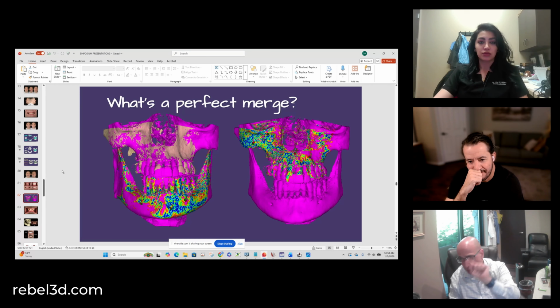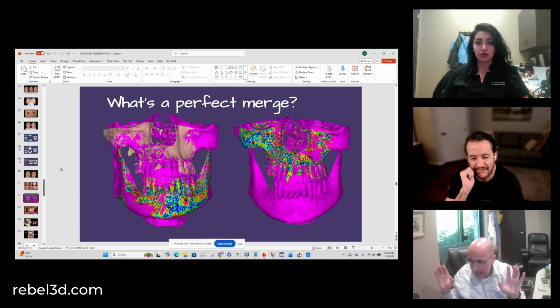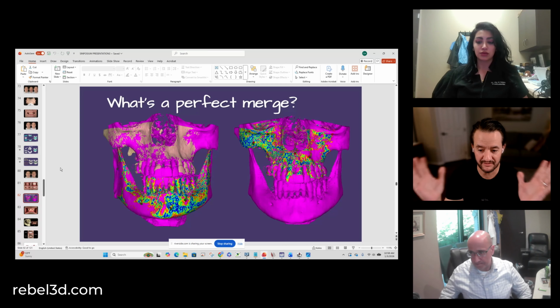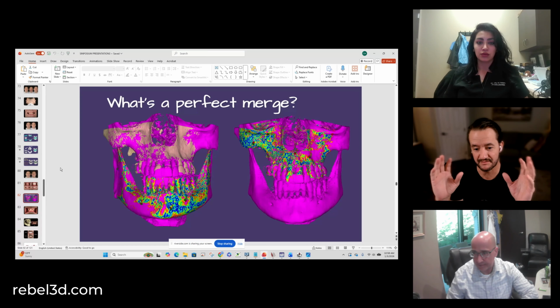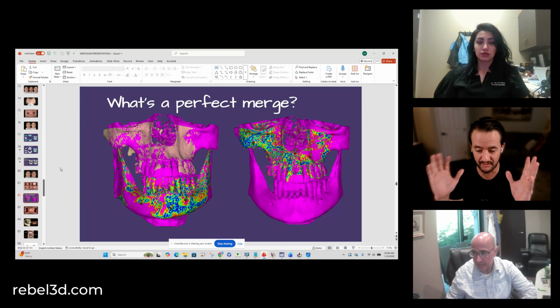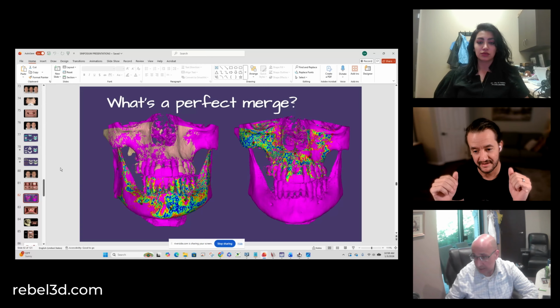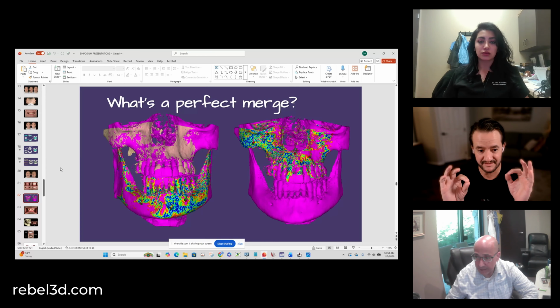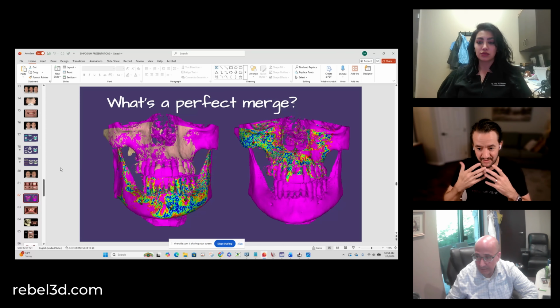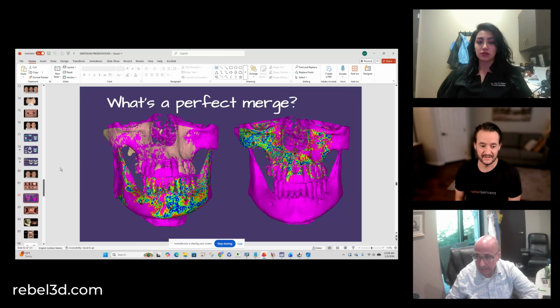Versus when you go with fiducial markers, the soft tissue, the software doesn't have only these dots to lean on. This is a really good point around just the volume of mesh data. The larger the surface, the more uniquely irregular the surface is, the better the software will identify it and merge it together. Right. And so if you have only a few small points versus this whole mandible here with unique attributes, it's going to do an excellent job merging and aligning that data, which is critical.